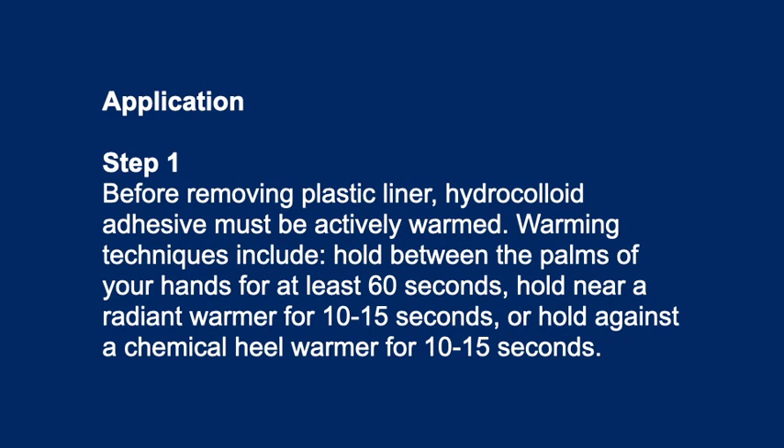Application Step 1: Before removing the plastic liner, the hydrocolloid adhesive must be actively warmed. Warming techniques include: hold between the palms of your hands for at least 60 seconds, hold near a radiant warmer for 10-15 seconds, or hold against a chemical heat warmer for 10-15 seconds.